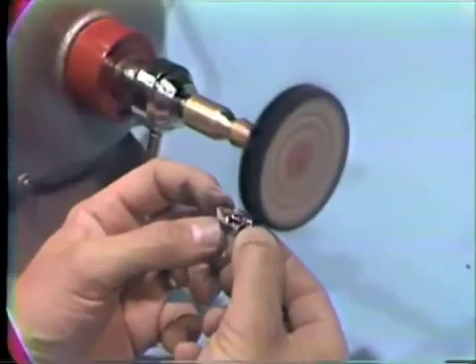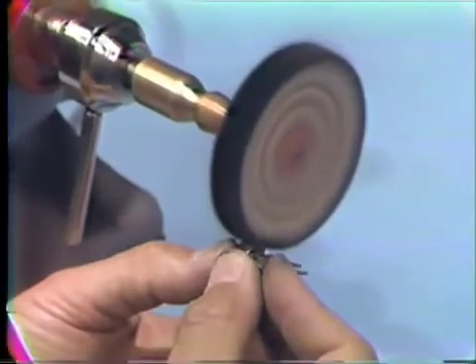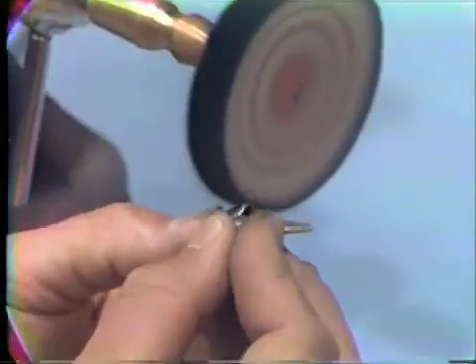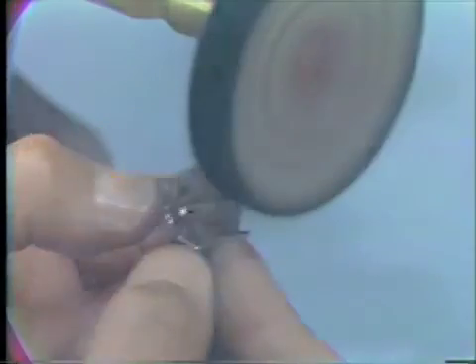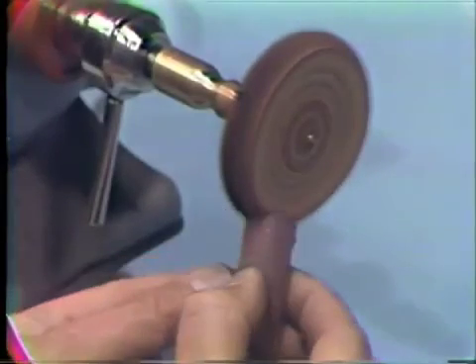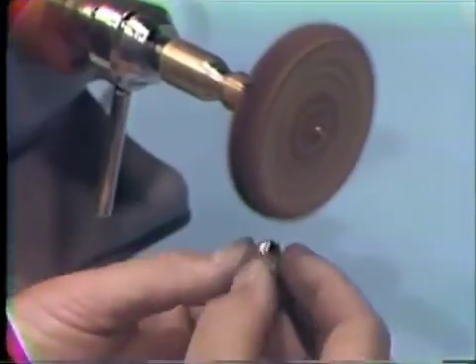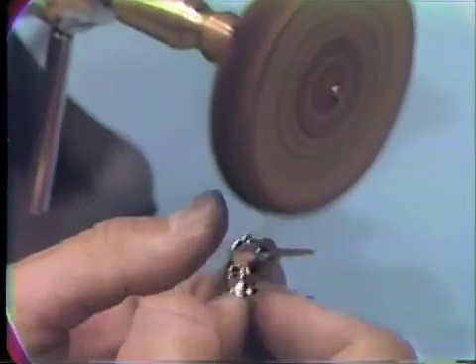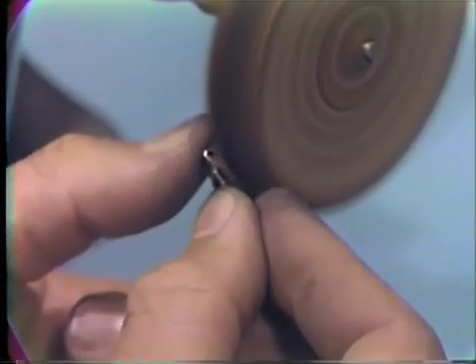A rag wheel impregnated with BBC compound can be used for polishing the lingual surfaces and the margins. Care must be taken not to polish out the centric stops, and care must be taken not to let the rotating rag wheel grasp the bridge and bend it. Rouge is applied to a chamois wheel and this is used to apply the final polish on the bridge. Again, care must be taken not to catch the bridge in the wheel and dislodge or bend it.